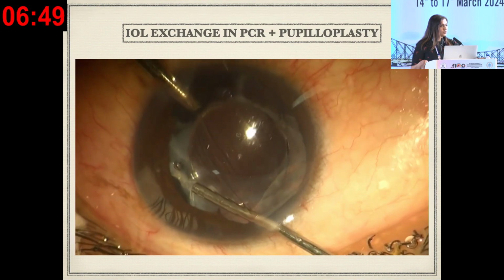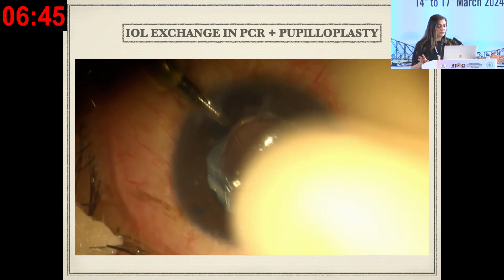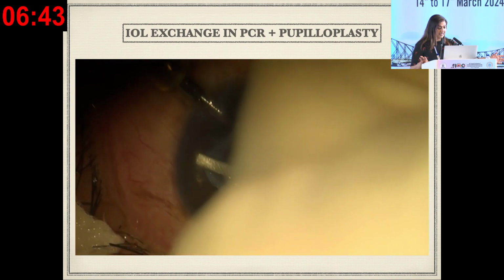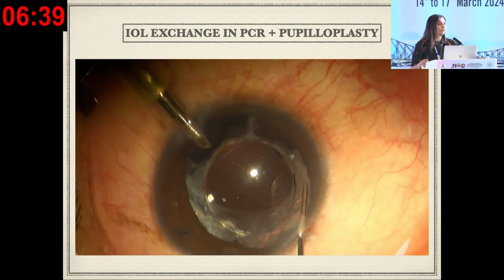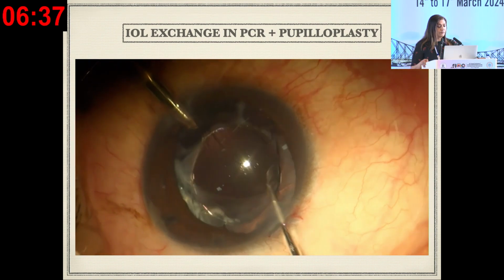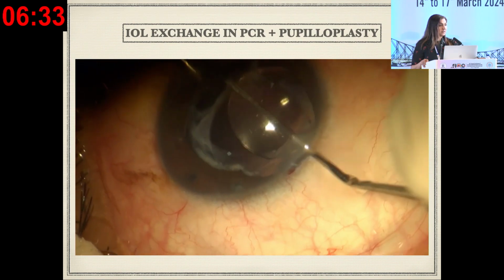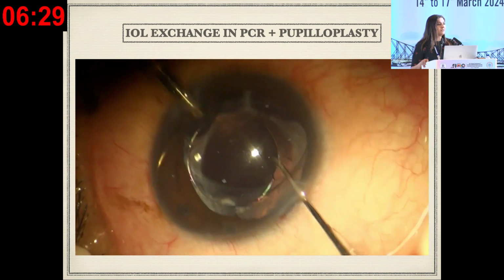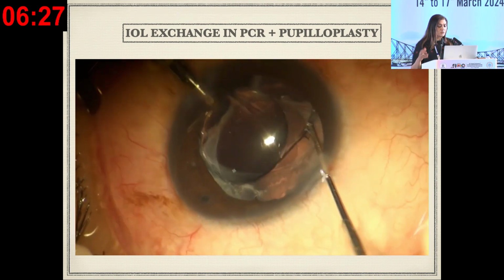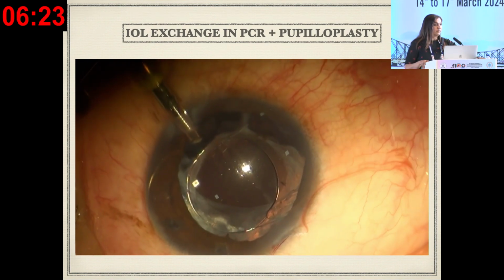But yes, this patient did have a posterior rupture, and this patient had a lot of glare, because you see that the pupil is not right, and there were some raised bouts of intraocular pressure for this patient quite often. So I decided that, okay, I understood that it's a one piece intraocular lens, and it has been placed in the sulcus. So let me remove this so that some of the bouts would go away after I remove this intraocular lens.